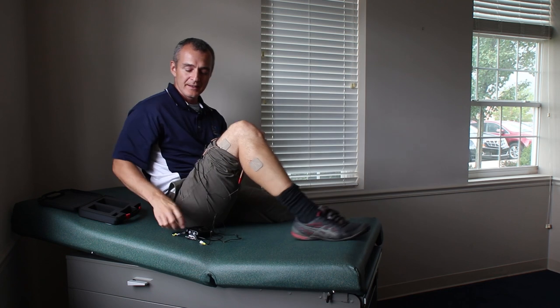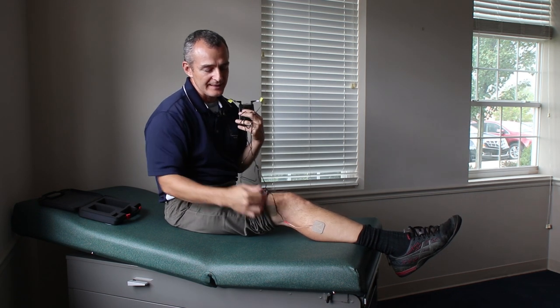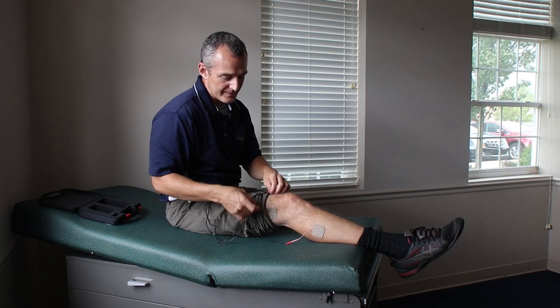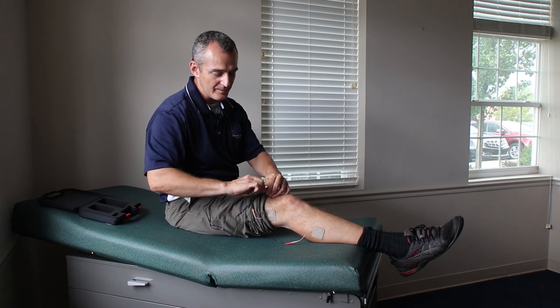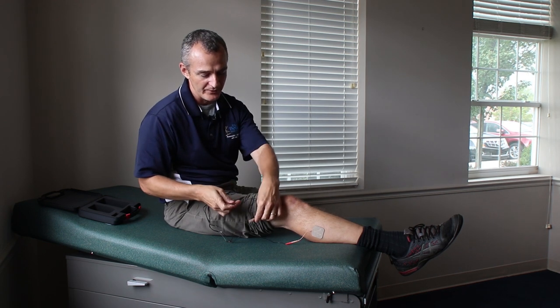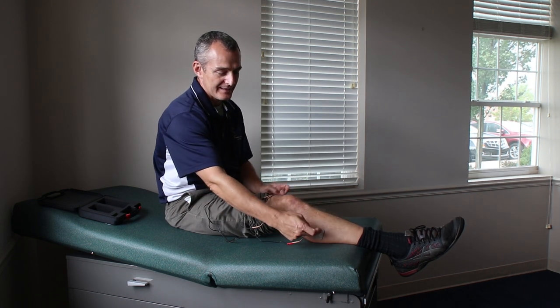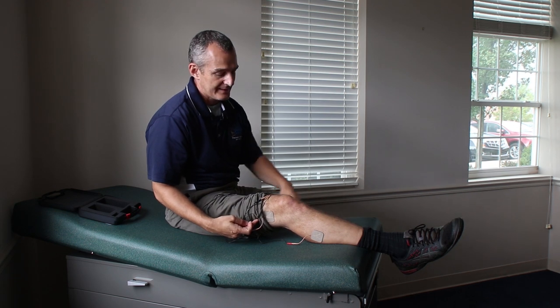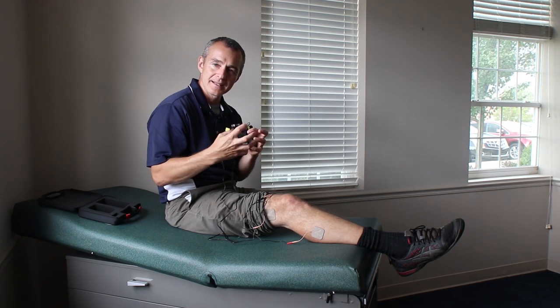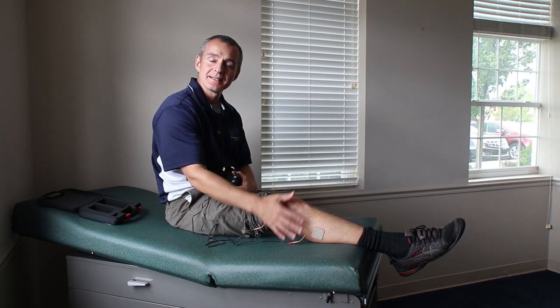Another application of the TENS unit: right now I've got the leads running in parallel — one on each side. But I can unplug the two top leads and switch the cables over so that without taking the adhesive pads off, the connections cross. Then again, turn it on to a comfortable intensity. You'll feel that buzzy, tingly sensation but no jumping or pulsing.